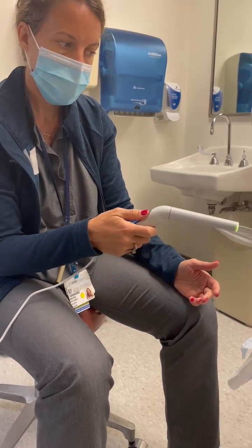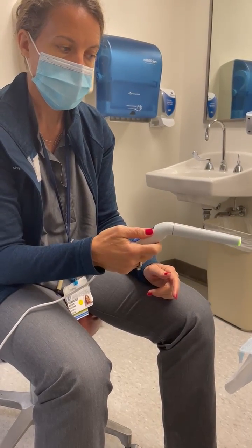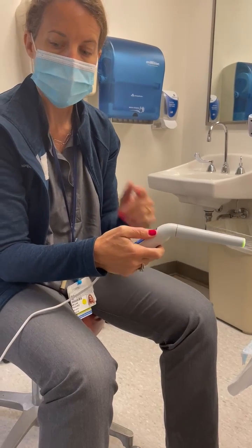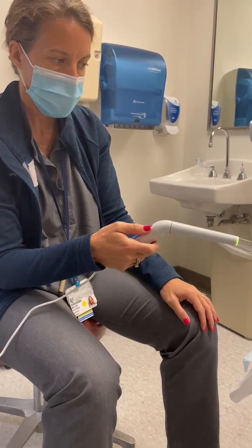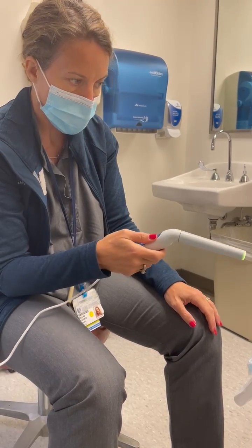When you have the image that you want, you press this button with your index finger — that's your image capture — and that will show up on the screen as you capture.